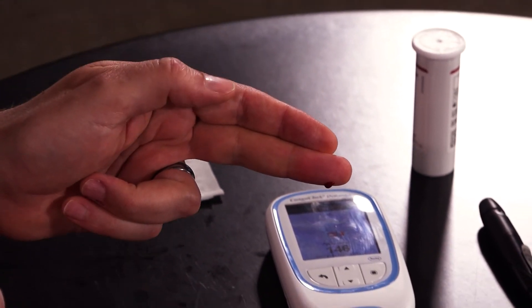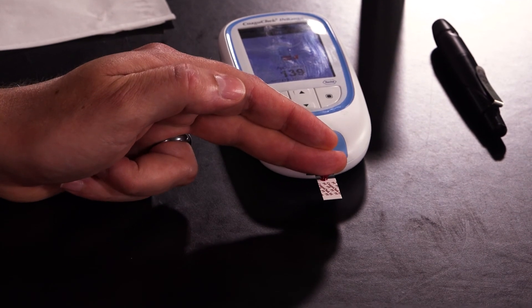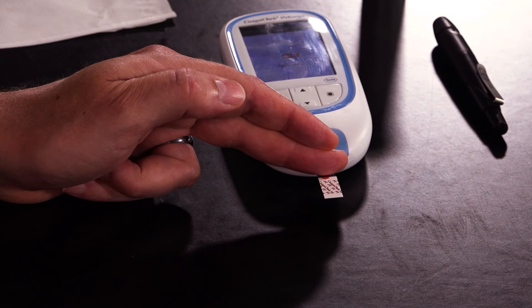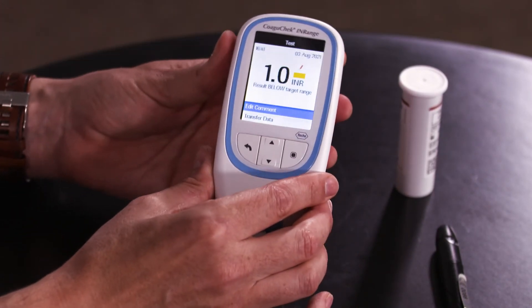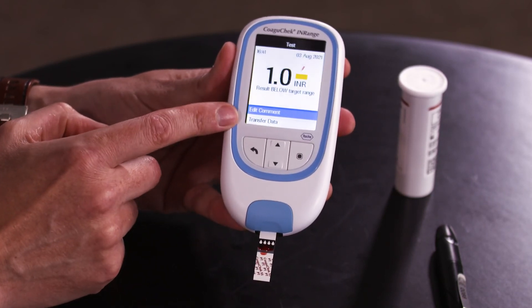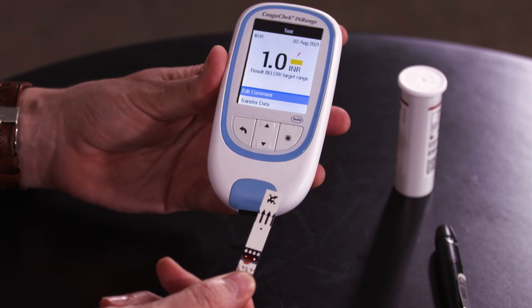Apply the drop of blood directly to the top of the clear section of the strip. Keep your finger held on the strip and the capillary action will suck the blood in. Remove your finger when you hear the beep. When the result appears on the screen you have the option to add comments and transfer the data.